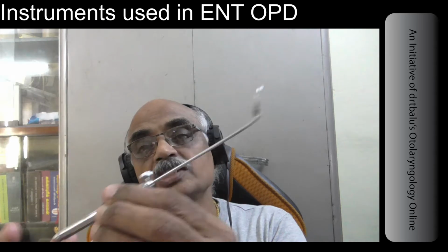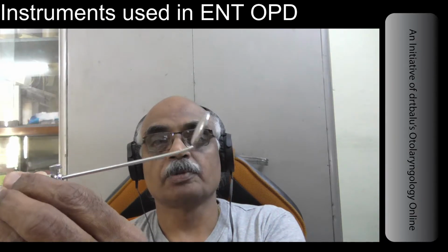This instrument is named after Garcia. Garcia is actually the person who conceived this mirror. He was actually not a medical person or a scientist. He was a singer by profession.